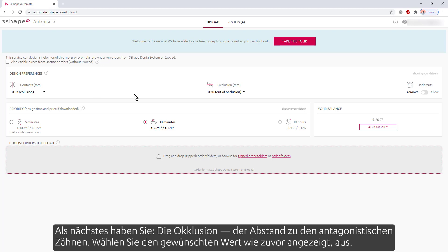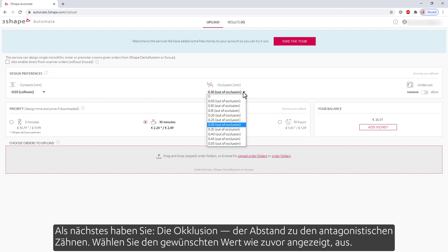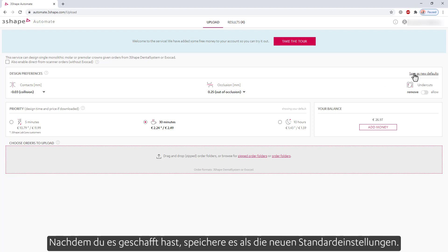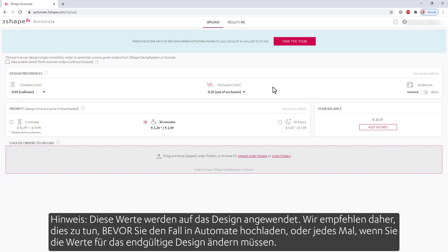Next, you have occlusion — the distance between the opposing teeth. Choose the desired value as shown before. After you've done it, save it as the new defaults. Note: these values are applied to the design, so we recommend doing this before uploading the case into Automate, or every time when you need to change the values for the final design.